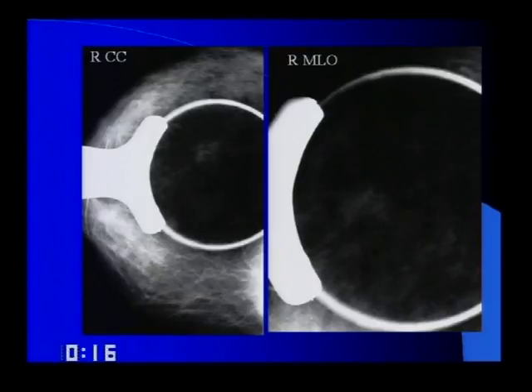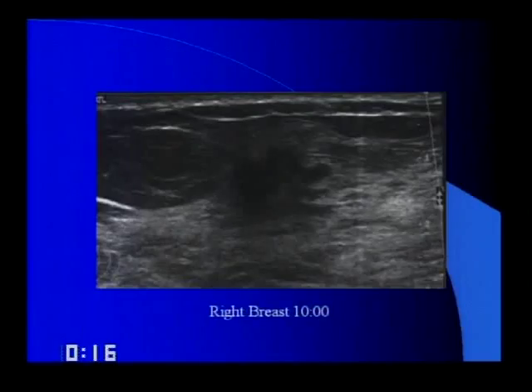Post-biopsy trauma. So here's the ultrasound. Here's the lesion. What do you think now? Well, I don't think this completely answers the question. It's a hypoechoic lesion with irregular margins. Radial scars sometimes don't show up on ultrasound, but can have this appearance, and masses can have this appearance. I think this has to be dealt with, probably excisional biopsy. We could biopsy it. Okay.